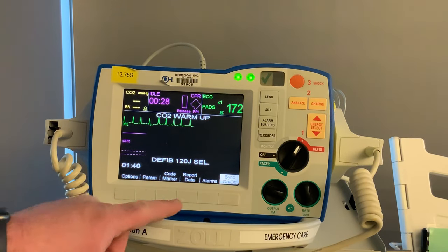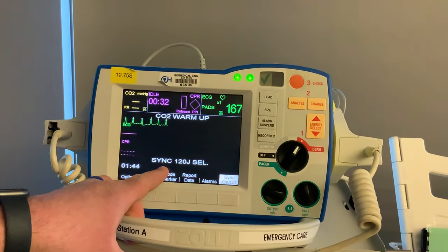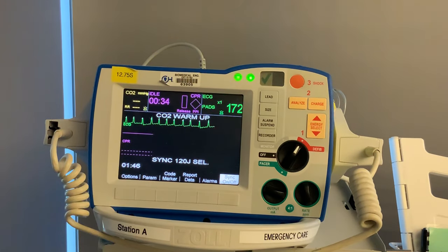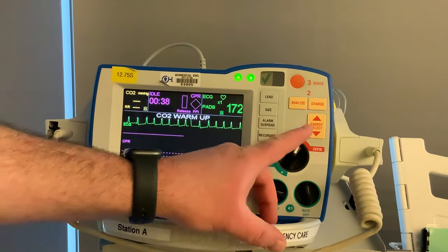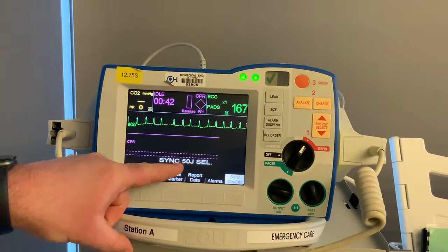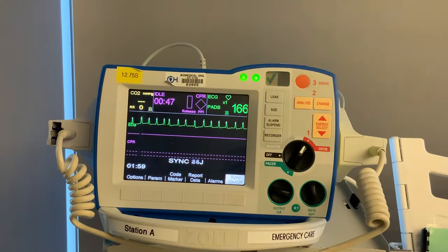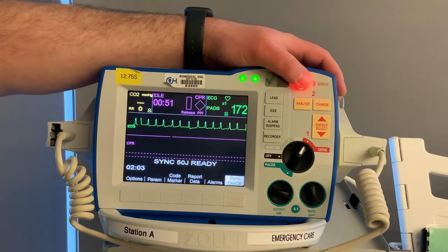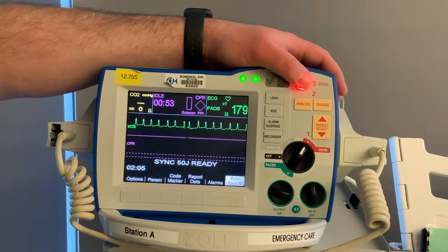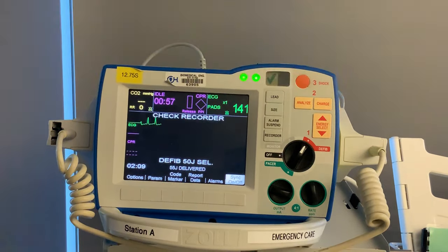Look at the bottom — you now have a sync button. If you hit that sync button, it will tell you you're in sync mode on the bottom and you're in energy selection. Synchronized cardioversion for an adult in SVT: your first dose is going to be 50 joules. Select your energy, push it down to 50. We're in sync mode. Hit charge, then put your finger on the shock button, look around, make sure the field is clear — I'm clear, you're clear, oxygen clear — and then hold that button in.